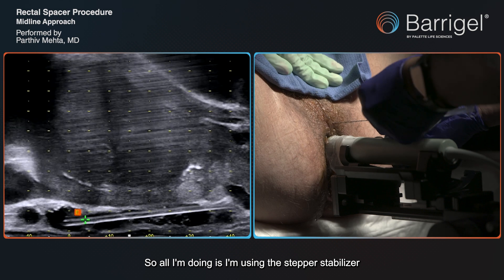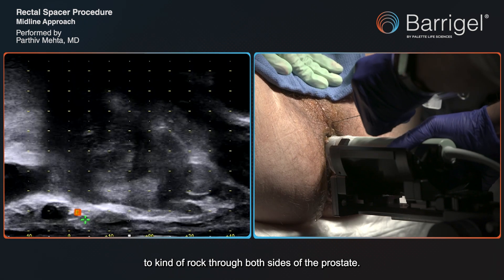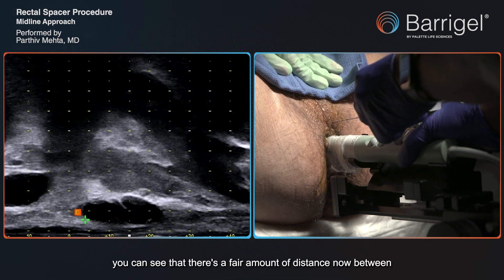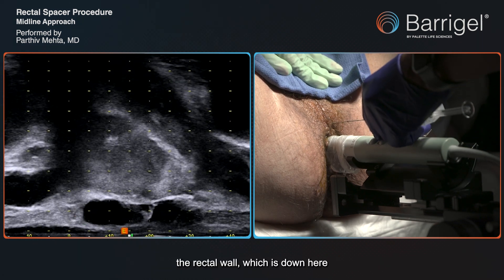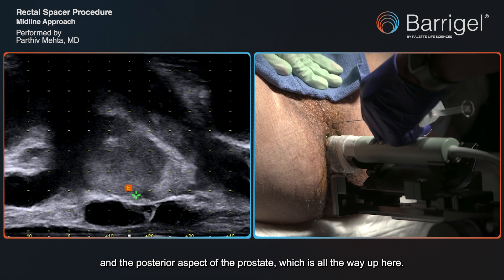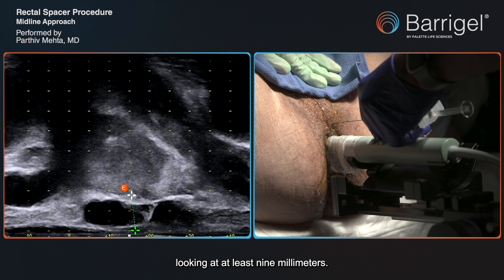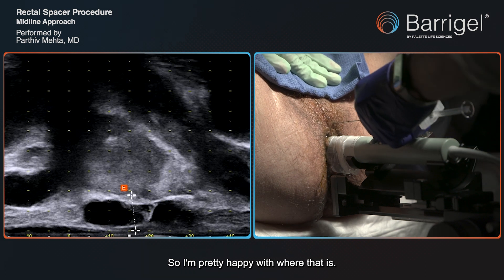All I'm doing is using the stepper stabilizer to rock through both sides of the prostate. If I go all the way over to his right side, you can see there's a fair amount of distance now between the rectal wall down here and the posterior aspect of the prostate all the way up here. We can even measure that — you can see we're looking at at least nine millimeters, probably a little more. I'm pretty happy with where that is.